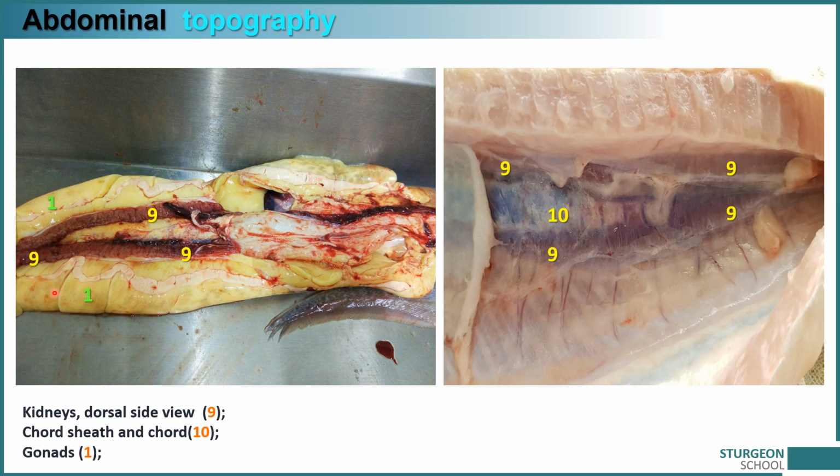The kidneys are located along the body along the dorsal surface of the fish body cavity. The right photo was taken from the abdominal side. In the left photo, the kidneys are dissected and we are looking at them as if through the back. Notice how close the kidneys are to the gonads. If the transducer is misplaced, the kidneys show up on the echogram instead of the gonads. Next we will see what the differences between the two are in imaging.